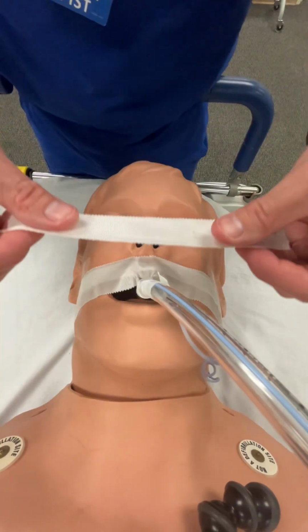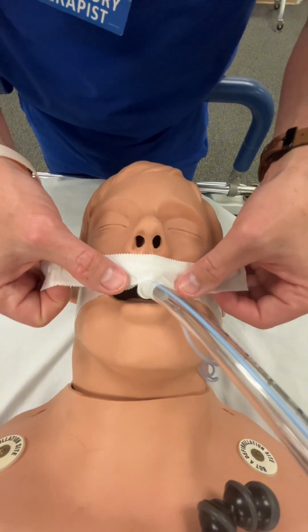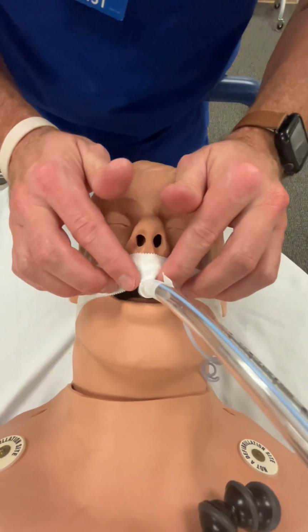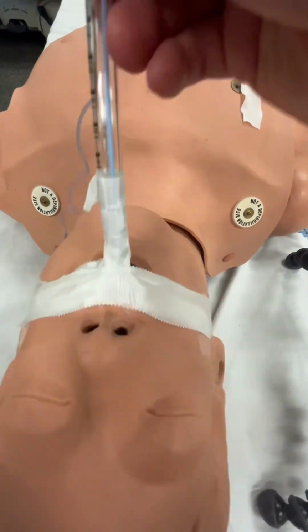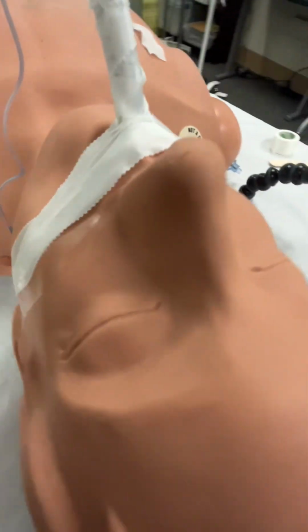Some people like to add an extra piece over the top just to make it look a little bit more presentable. This is not necessarily needed, but you can absolutely do it if you'd like it to look a little bit nicer. Okay, so we're all done. This thing is really secure. I am yanking on this thing. It is not going anywhere. He probably is going to need a cervical collar after that, but it's secure.